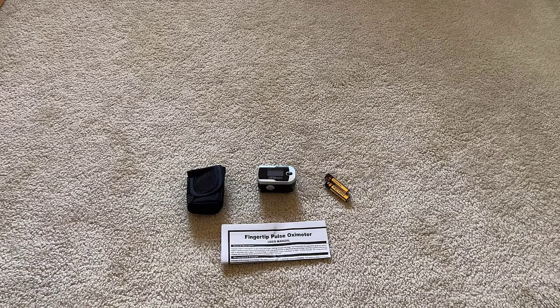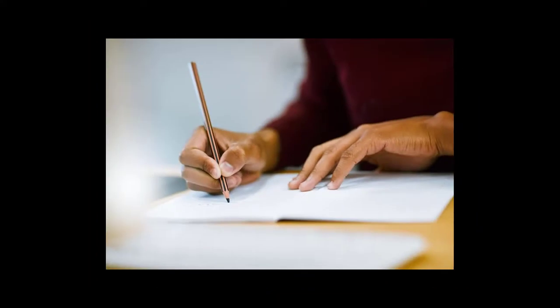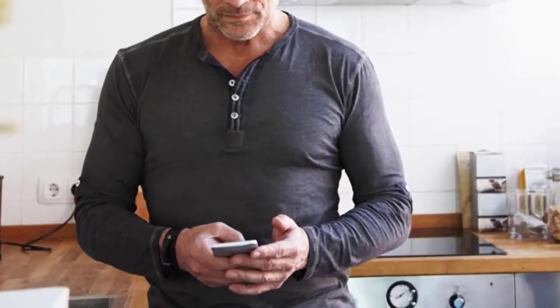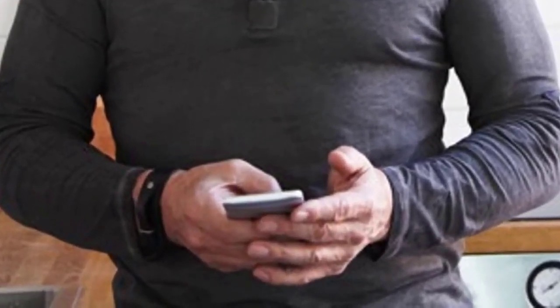This unit does not keep a memory of past pulse and heart rhythms, so if you want a history, write it down or log it onto a spreadsheet. This is a basic oximeter, so there's no Bluetooth or capability to sync with your smartphone.